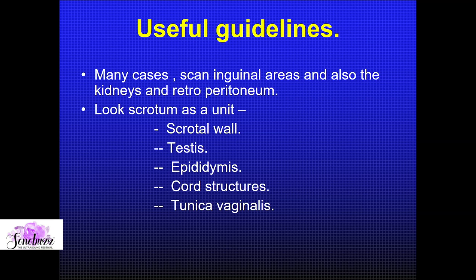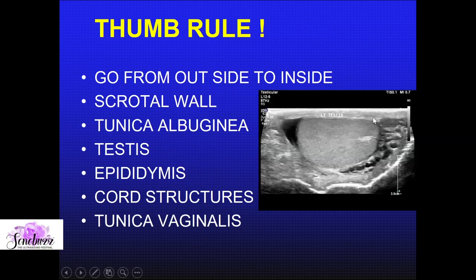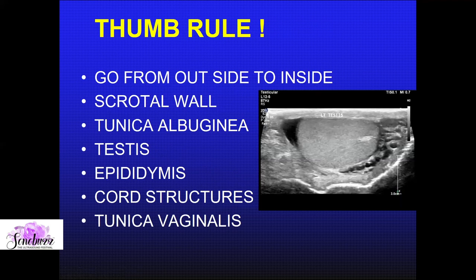In the scrotum itself, use a systematic approach — go from outside to inside. Start with the scrotal wall, then the hyperechoic Tunica albuginea surrounding the testes, then evaluate the testes themselves. Once you finish the testes, extend your scan to look at the epididymis, cord structures, and Tunica vaginalis. If you follow this protocol, you will be able to successfully evaluate most scrotal pathologies very confidently in day-to-day practice.